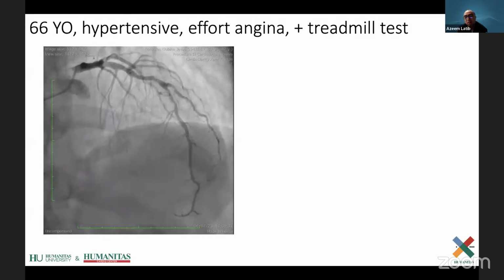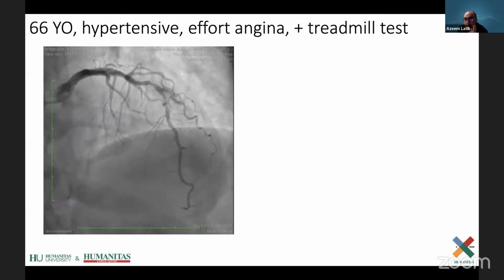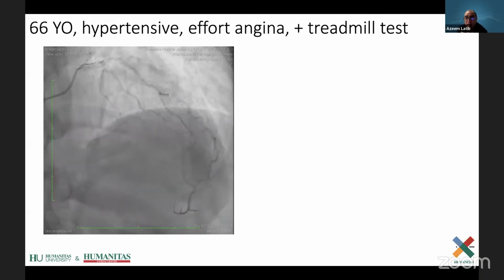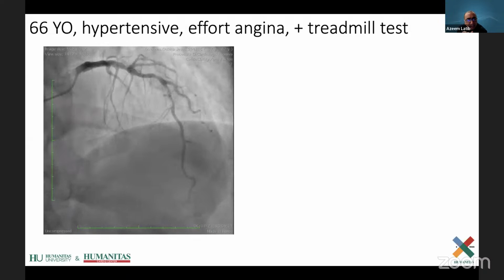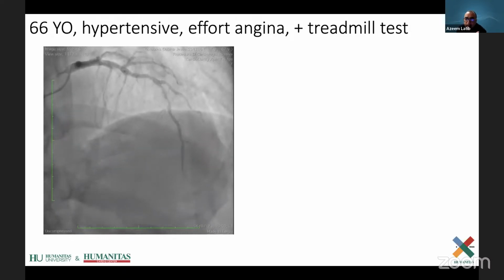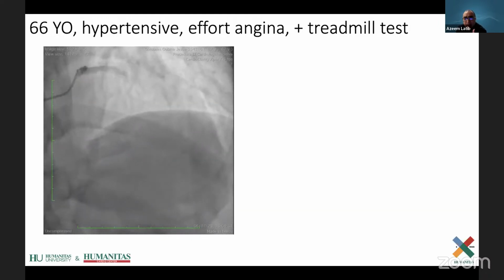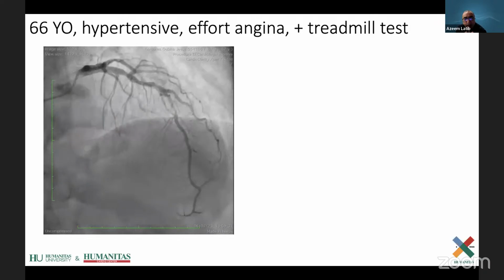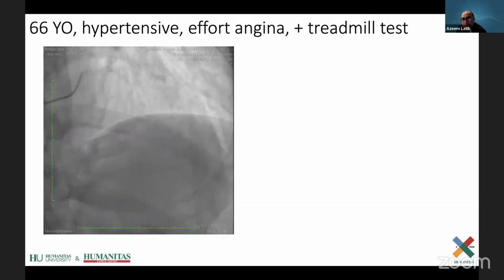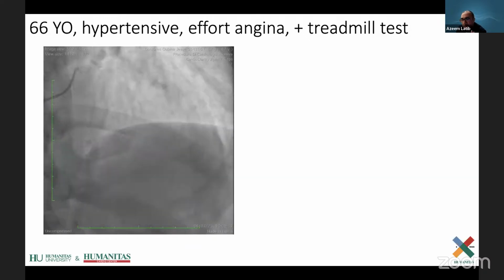So I think, different to the other cases you showed us, Antonio, the calcified area is longer here. Okay, it's not as focal. So I'd be thinking about rota, maybe a 1.5 or even 1.75 burr. It's a really big LAD, but I'd really be thinking about using rotablation in this case, just because it's longer, and I think I'm going to make my life easier.